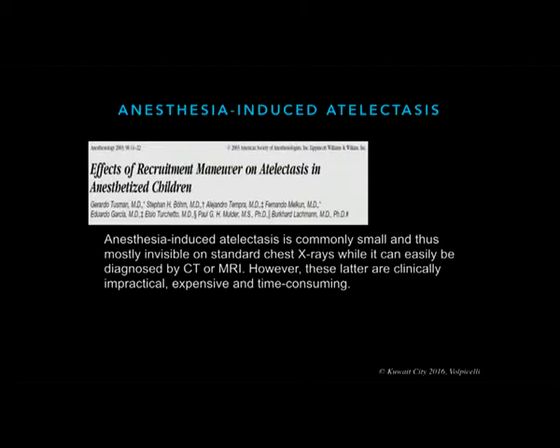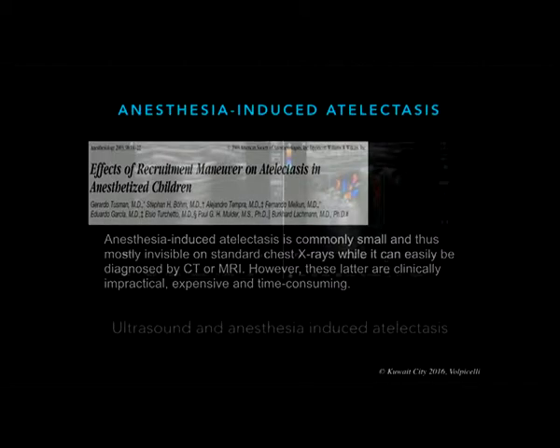So the only way we have to assess this kind of conditions in the lung during the operative scenarios is to use lung ultrasound.